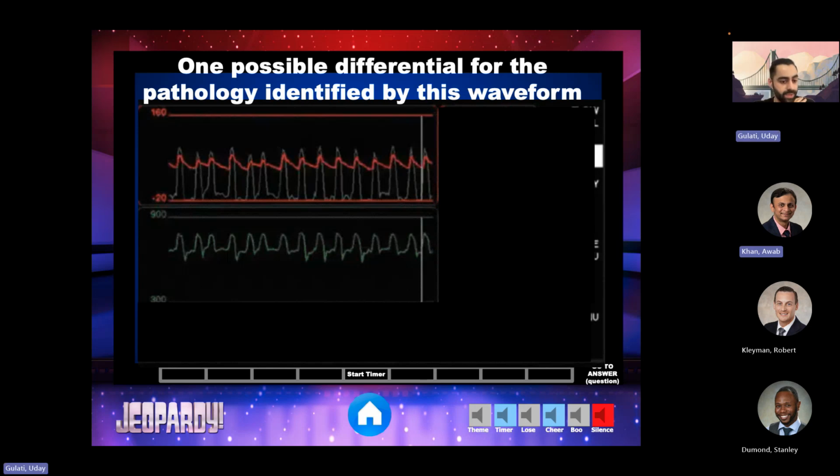Is there clots? Nope. Jared, I don't think clots would cause this, right? I don't think you would see it on the motor current waveform. If you saw clots, you would see it in your purge pressure. So what was the motor varying? Look at your other waveforms.